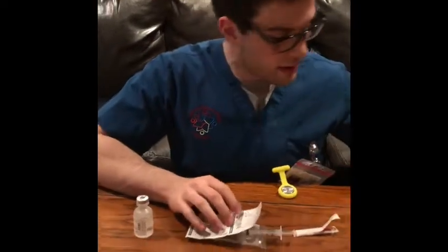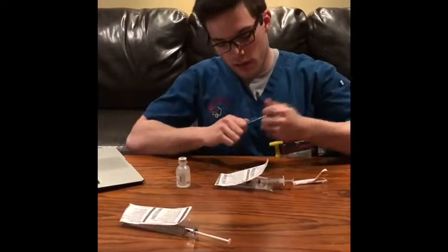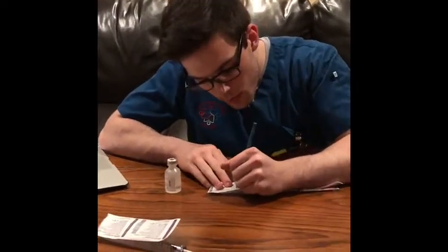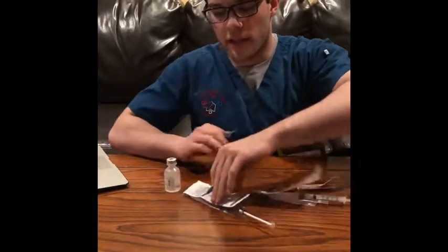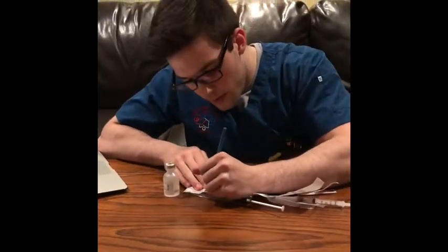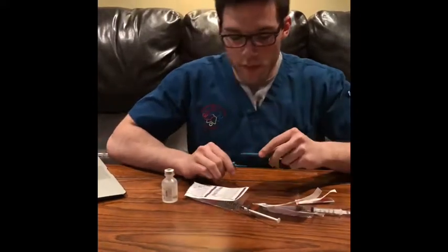And then upon completing both medications, I would use a pen or marker and just mark down the patient's name and room number, so that when I do go to administer the medications, I just have one more certainty to rely on that this medication is for the right patient.